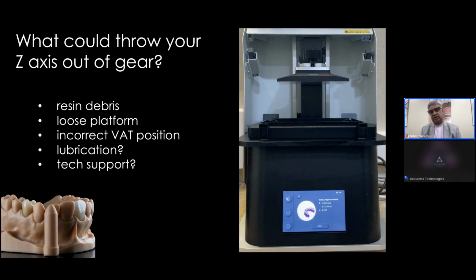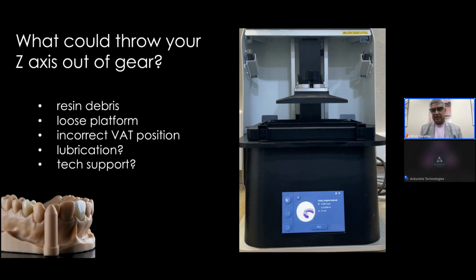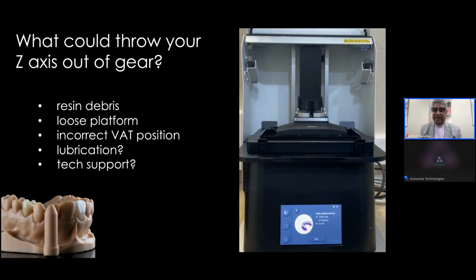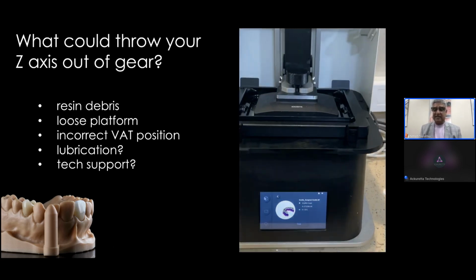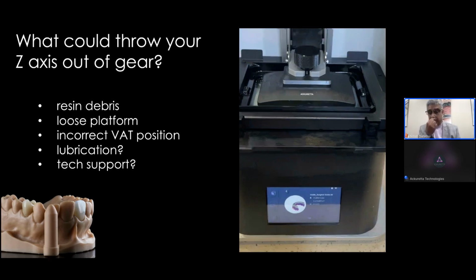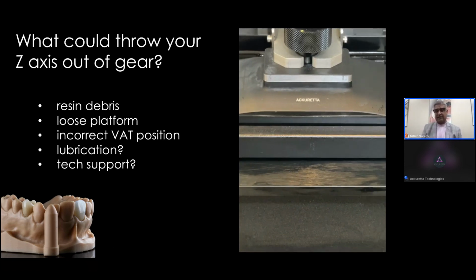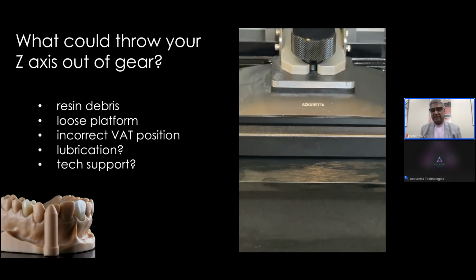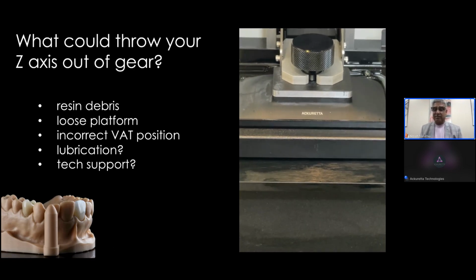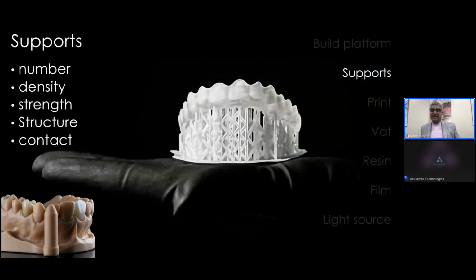So the platform, I never tire of seeing a video of the platform coming into my resin and displacing the resin. In this case, I think I have a surgical guide resin or a splint resin in the tray. I don't remember. Now it's a surgical guide resin. I just saw that on the screen, and so I can see the profile. This is the one where I was experimenting, but you can see how the resin just comes up around the platform there. Yeah, I don't know why I like seeing that.